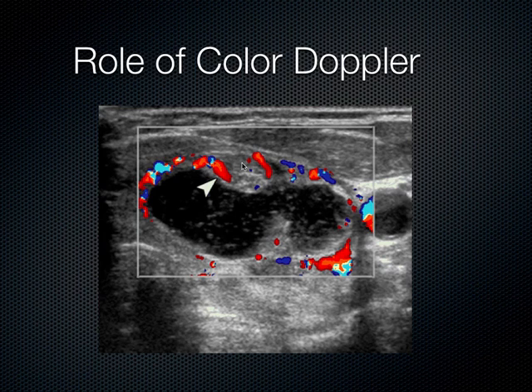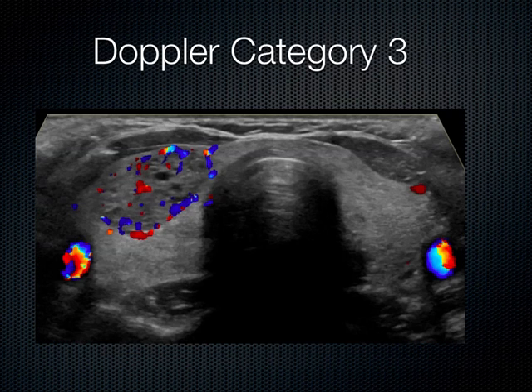This lesion was actually biopsied under ultrasound-guided fine needle aspiration, and it was shown to be benign under cytologic examination. This is Doppler category 3, a moderately rich flow pattern to this nodule here. So normal-looking thyroid here. We see the carotid artery over here, and we come across the isthmus. This is the trachea. We see some mirror image artifact of the isthmus here.